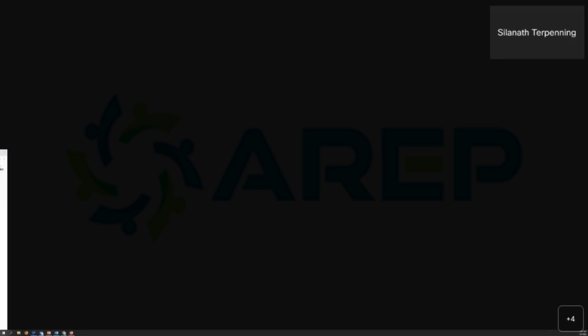Okay. This is JP, may I interrupt just for a little bit? Sure. Because I think this is important for this question, the same question about the MR arthrography. Our attendee asked about the ABER position. Is it difficult to do that? Or if it's difficult, do you have any tricks or tips to make it easier?